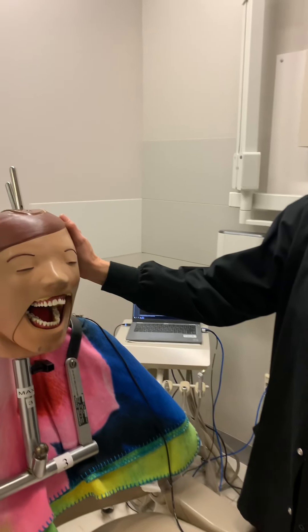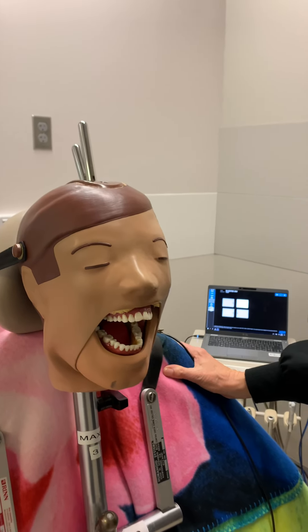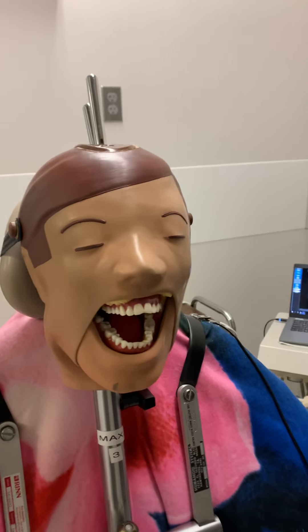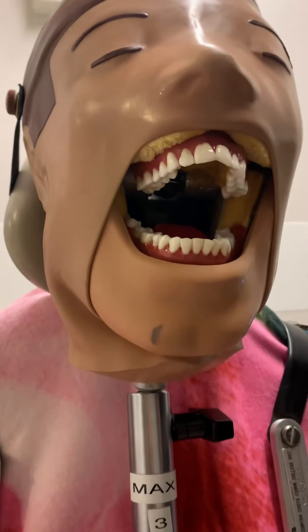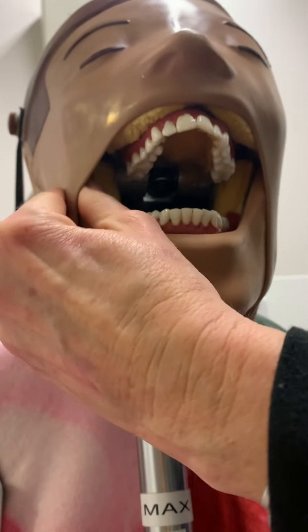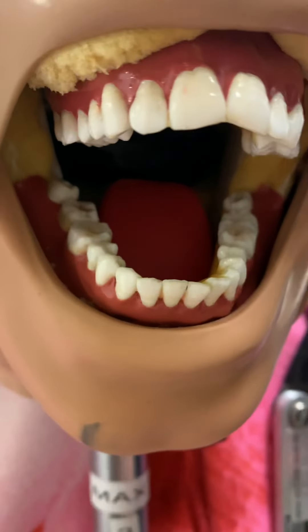We have a patient here that has some wisdom teeth, so we need to take distal oblique posterior exposures. I can see three of the wisdom teeth, but I cannot see one of them, which is number one. So we need to make sure that that tooth is either missing or impacted.